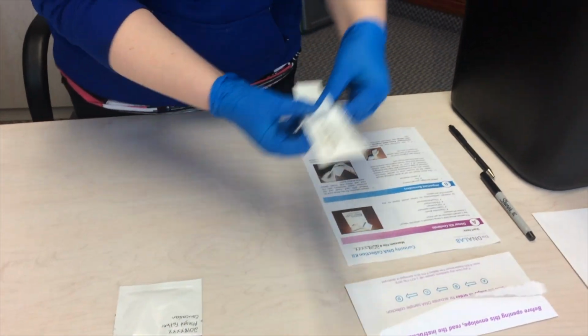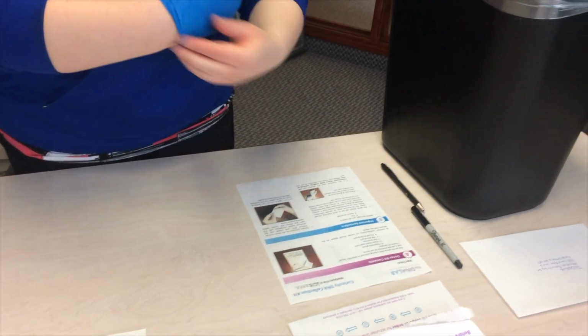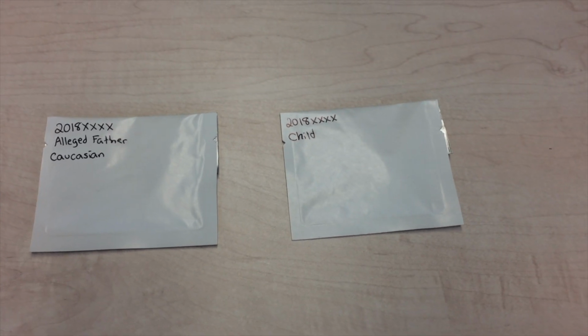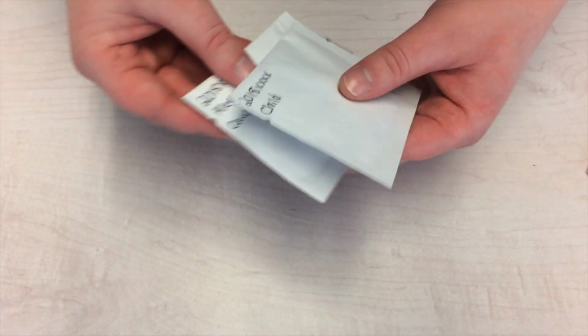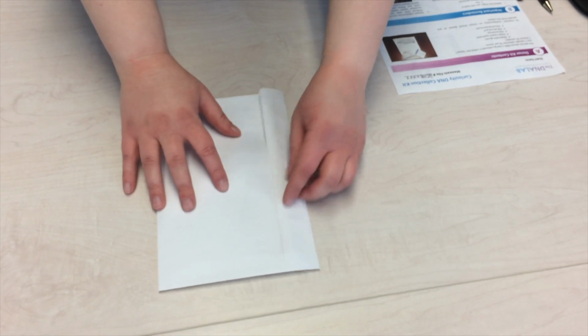Throw out the foam swab, the gloves, and any other disposables. Repeat all of these steps with a new kit to collect the next donor's DNA sample. Once all samples have been properly collected and labeled, place the foil pouches in a return envelope and mail it to our paternity office.